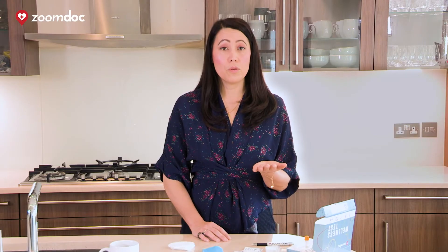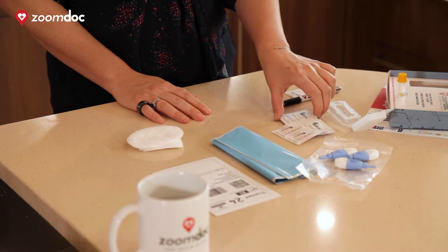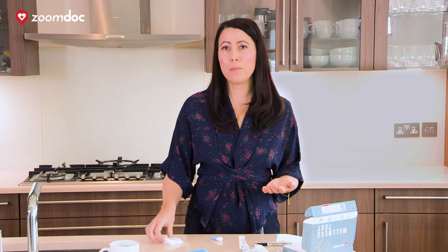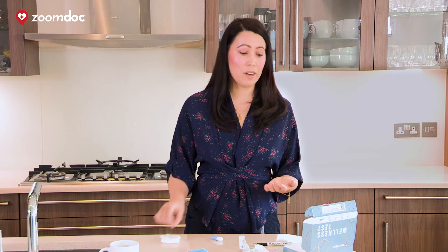You're going to use your non-dominant hand and the best fingers to use are your middle fingers. Take an alcohol wipe and clean the tip of the finger. Grab a lancet, have your cotton pad handy, and now we're ready to open the vial.